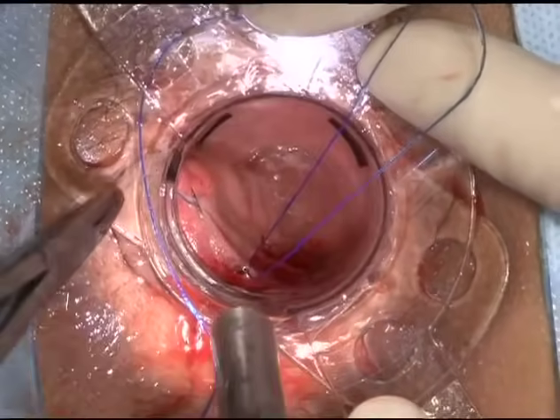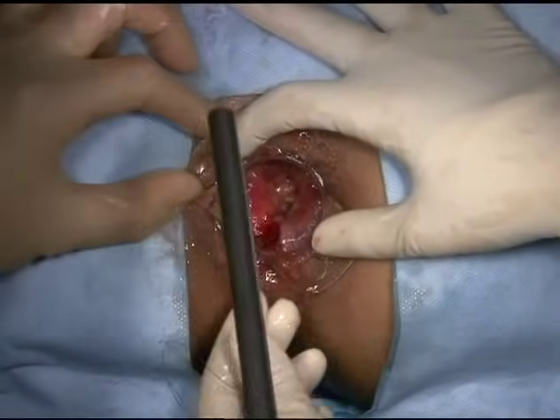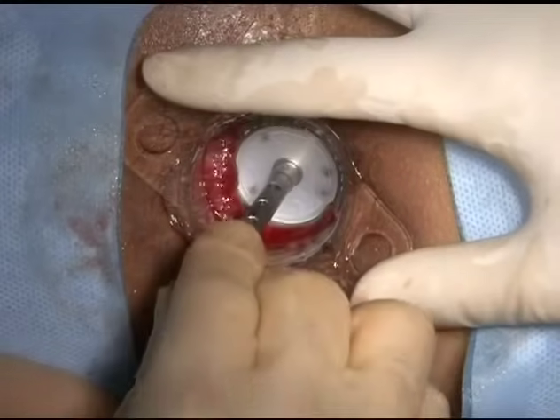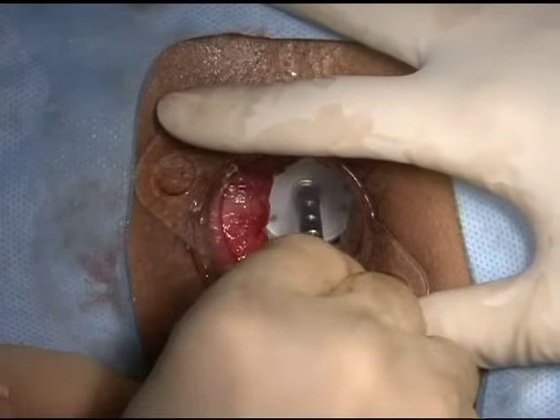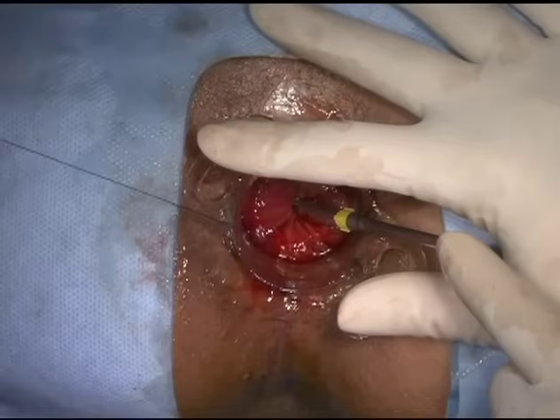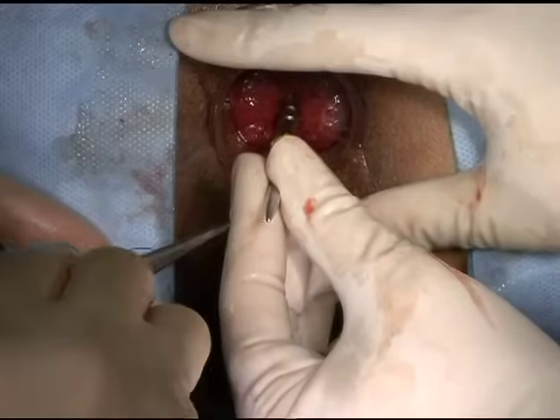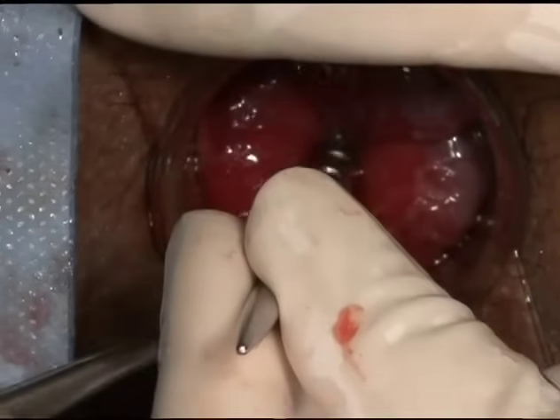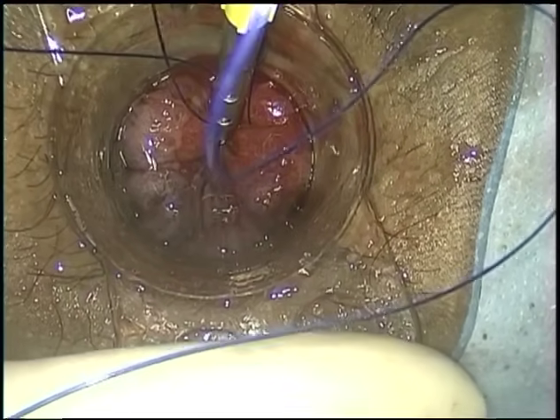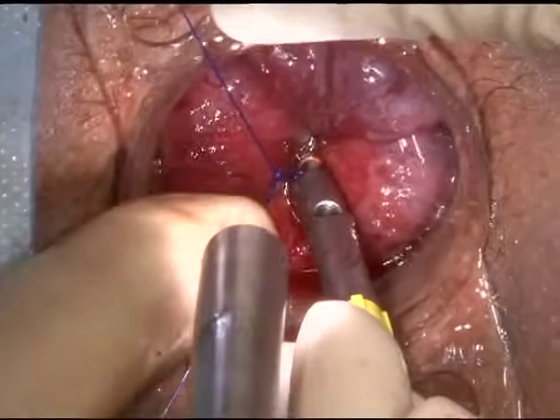After the purse-string is completed, remove the needle from the suture and release the hemostat from the free end. Digitally or visually assess the amount of tissue to be resected and select an appropriate anchor hole on the center rod. Insert the detachable anvil into the rectum so that the anvil is positioned proximal to the purse-string suture. Insert the purse-string suture around the center rod and pass one end through the appropriate anchor hole, then pass the other end through the same hole but in the opposite direction. Secure the tissue to the center rod with appropriate purse-string tension and knotting.